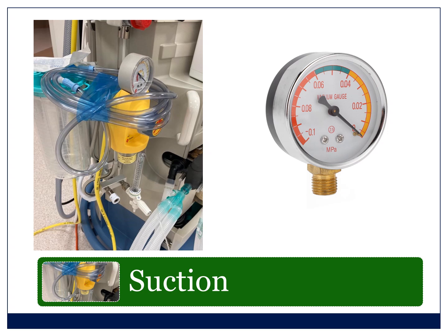So you switch the suction on. You occlude it or bend the pipe so that the suction is occluded, and you look at the gauge to make sure you've got enough suction. And we normally call between minus 30 and minus 50 enough, and make sure you've got a rigid suction catheter, a Yankauer, attached to that suction pipe.